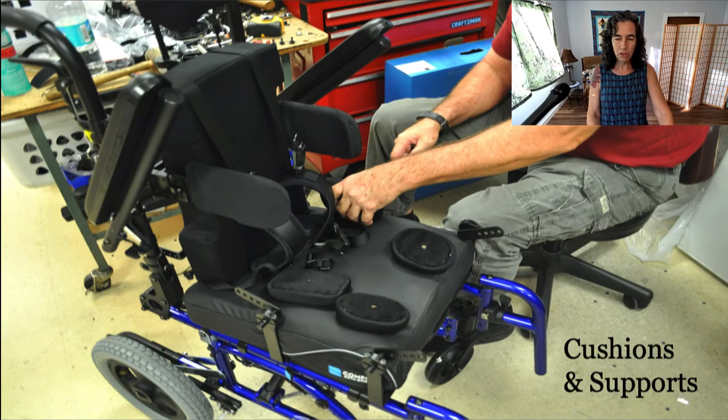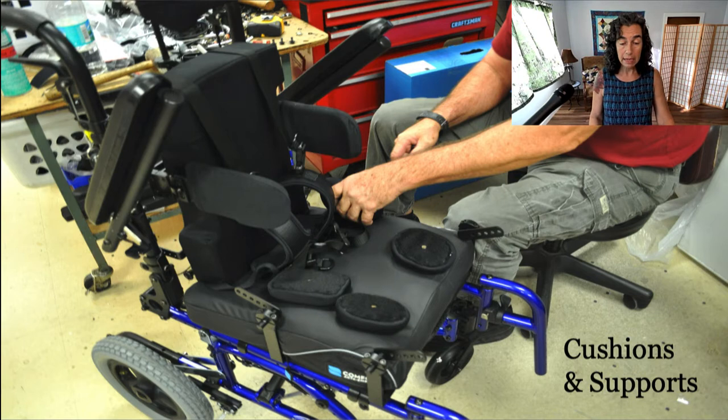All right, so cushions and supports. We have a couple different varieties. We have custom and also off the shelf. And notice in this photo, I like it because they're adding lateral supports as well. And that would be very handy for anyone who has difficulty with trunk control, strength, or endurance.